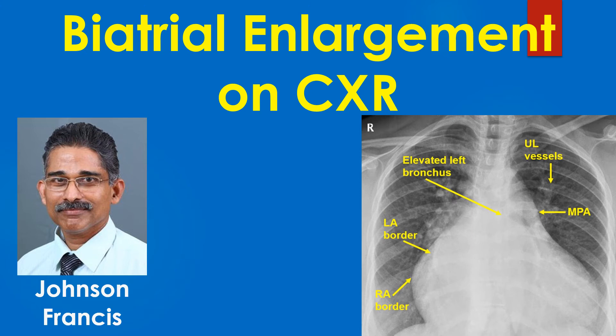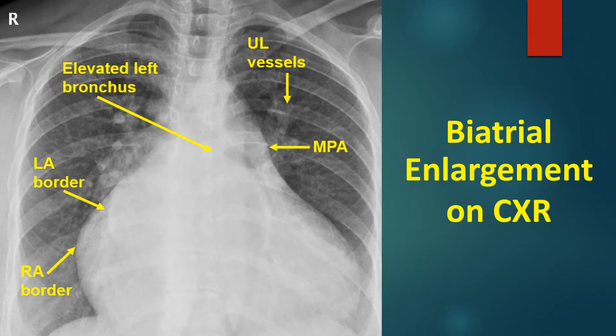Bi-atrial enlargement on chest X-ray causing cardiomegaly with a right ventricular pattern of apex, which is lifted up, is discussed here. Right atrial enlargement is evidenced by the shift of the right cardiac border grossly to the right side. Left atrial enlargement is seen as a double contour within the right atrial shadow — a shadow within shadow.